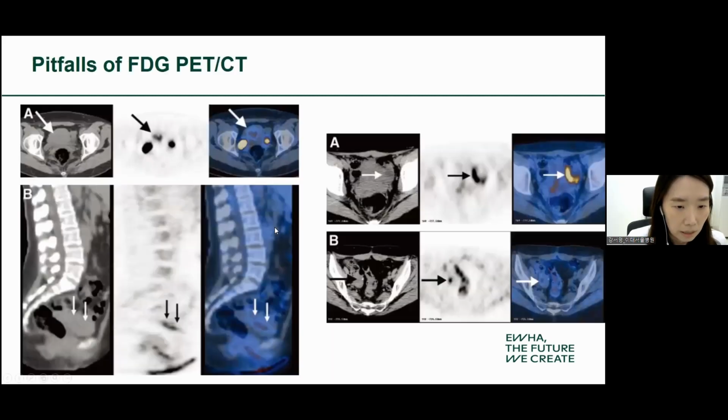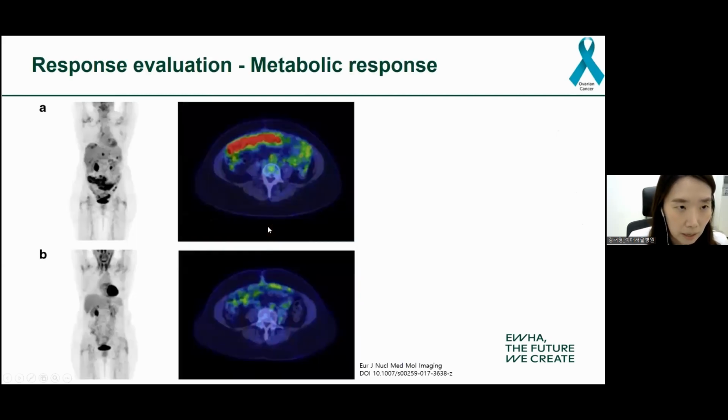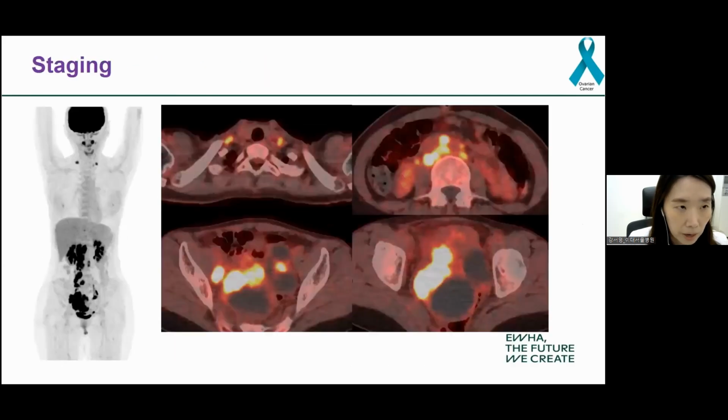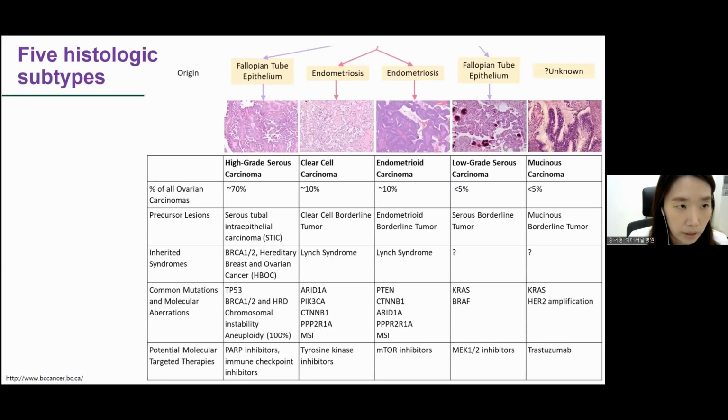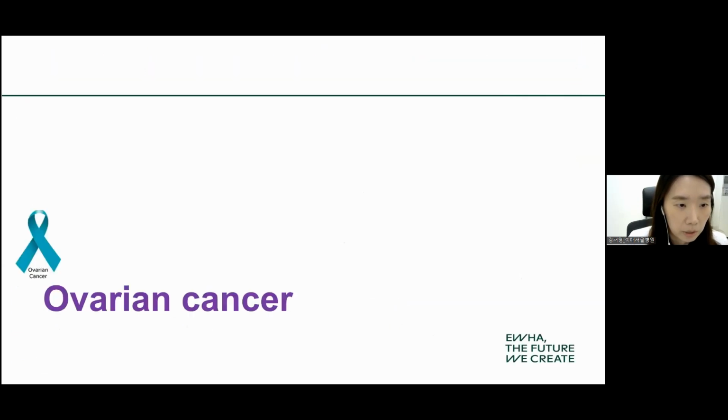Yeah, okay. In this slide, I didn't deal with adenomyosis, but I think the uptake of adenomyosis is very similar to the leiomyomas in the uterus.